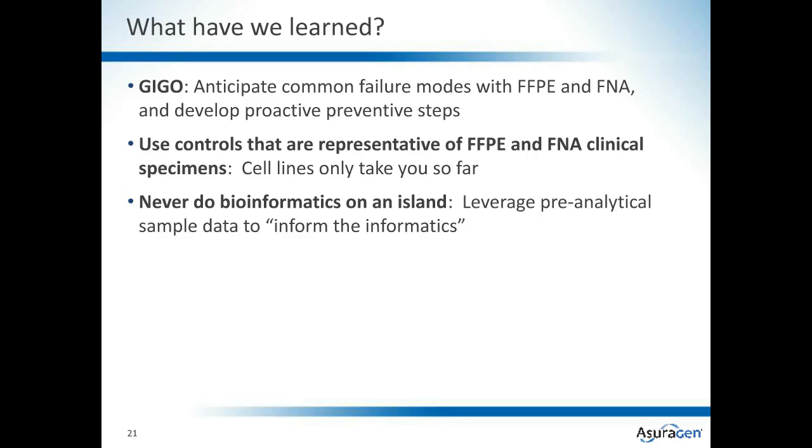It's also important to use controls that are truly representative of the specimens you're going to test, and we've really focused on FFPE for that purpose. And finally, you should never do bioinformatics in a vacuum. It's really critical to leverage the pre-analytical sample data and other inputs across the workflow and QC metrics to make sure that you can draw the right conclusions.